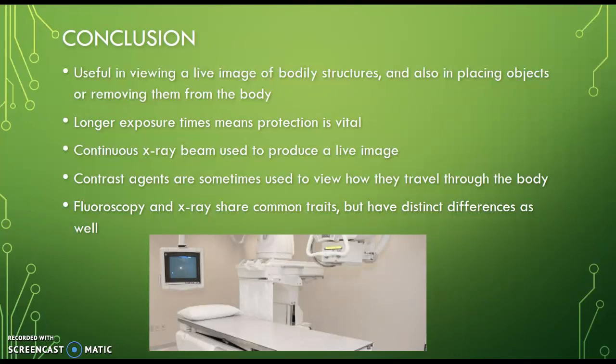To create the live image, there is a continuous X-ray beam passing through the patient and on to the image receptor, which then gets passed on to the monitor. Contrast agents are sometimes used to view how they travel through the body. An example of that, again, would be the swallow test on the first few slides.